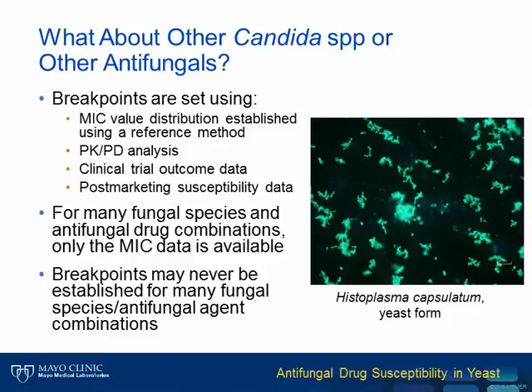But there's another piece of data that is beginning to become available for certain bacteria and fungi that can provide some insight into whether a particular isolate has a typical wild-type MIC profile, or if the isolate may have acquired resistance to a particular agent. That piece of data is known as the epidemiological cutoff value.